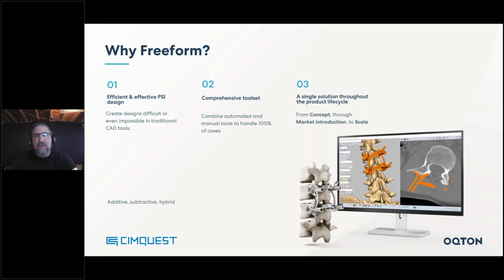Freeform supports you there by allowing you to create guided workflows to help with compliance, progressive automation to help you build up automation to make your process more efficient, and eventually evolve into larger workflows. And as you achieve success, you can scale for mass customization, and you don't have to leave the software you're comfortable with. Freeform grows with you, and it is a wonderful tool, and it's actually a pleasure to use, which is helpful for having a happy staff.